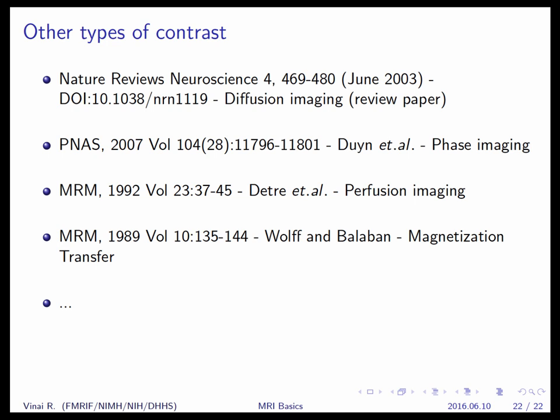Okay. And then you adjust and send radio frequencies that match the gradient. What I was trying to get at is you can play these things in an infinite number of orders and patterns, and it's really to bring out the different types of tissue and the contrast inherent in the tissue. So there's no fixed pattern.